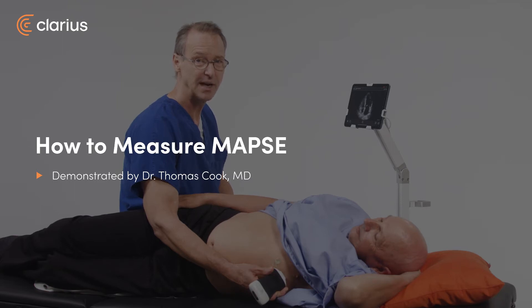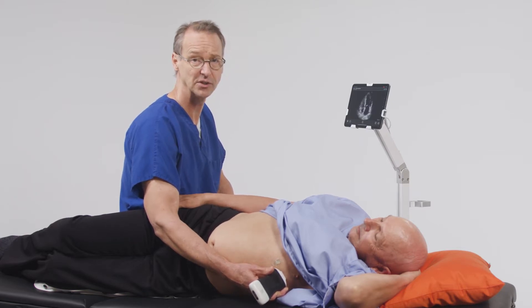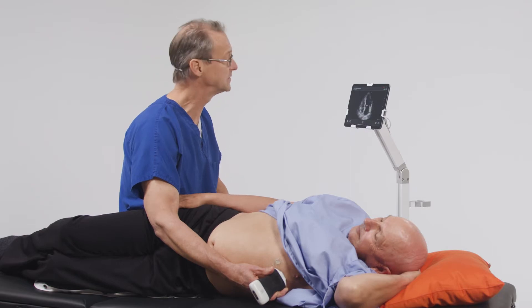Hi, I'm Tom Cook. I'm an emergency physician and I practice with Prisma Health in the University of South Carolina. This is a short video discussing the use of MAPSI as a way to assess left ventricular function. MAPSI is an acronym that stands for Mitral Annular Plane Systolic Excursion, and it's a very simple way of evaluating for left ventricular function in your patients.